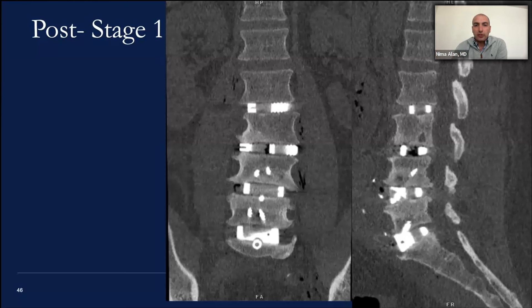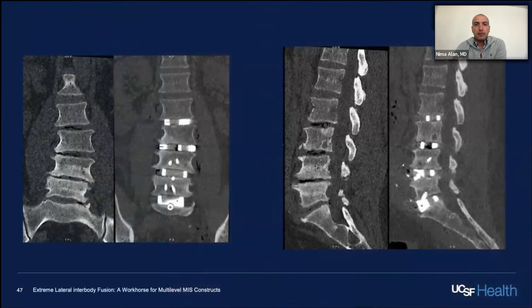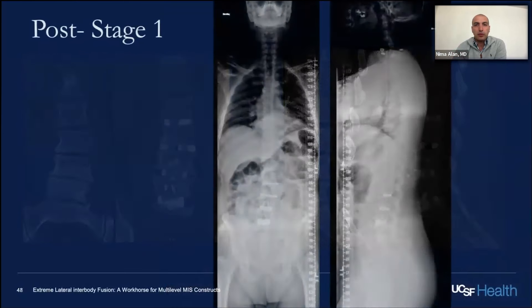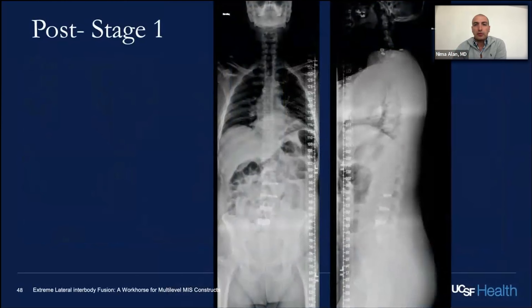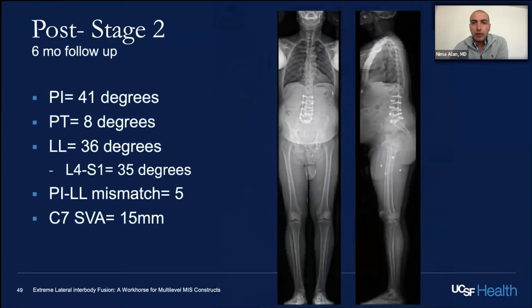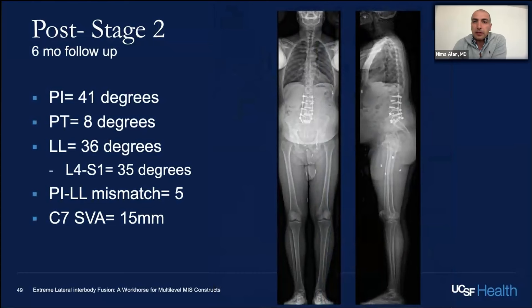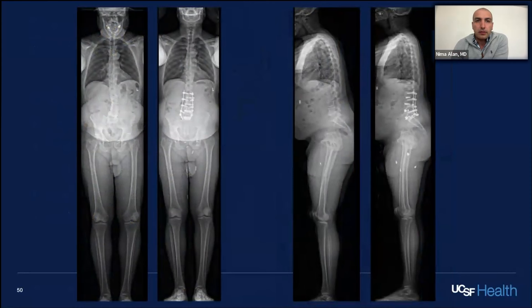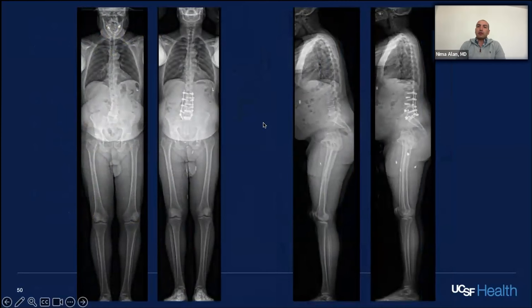This is the correction achieved, and you can see the fractional curve is corrected with the ALIF. Pre-op to post-op from stage one — he can now stand straight. One of those rare patients who immediately after surgery says the pain going down the left leg has improved, which I think is from indirect decompression at L4-5 to L5-S1. Posterior fixation with percutaneous screws L2 to S1, same pelvic tilt, lumbar lordosis improved, most of it now at the bottom. On the EOS images you can even see knee flexion is improved from pre- to post-op.